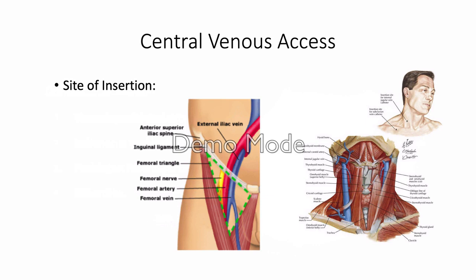Comparing that to the femoral vein, the femoral vein lies more medial to the femoral artery. This will be more important when you are doing your ultrasound to judge which is the artery and which is the vein. This is an aid plus the features that I believe were mentioned by Dr. Talag in his ultrasound lecture.